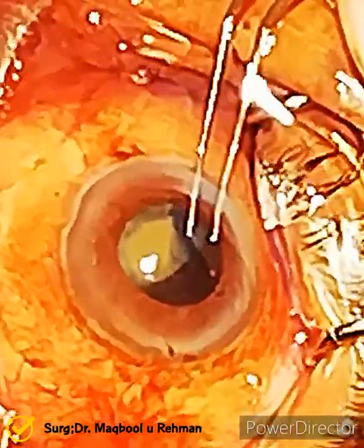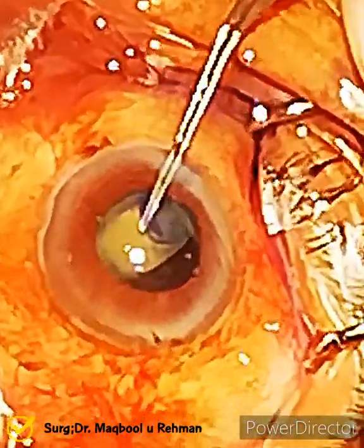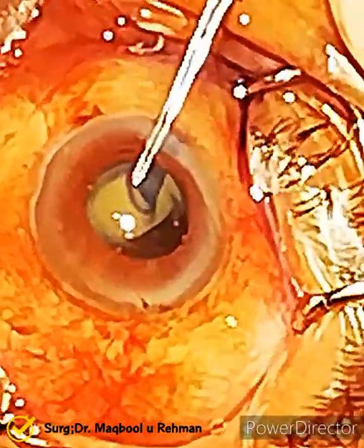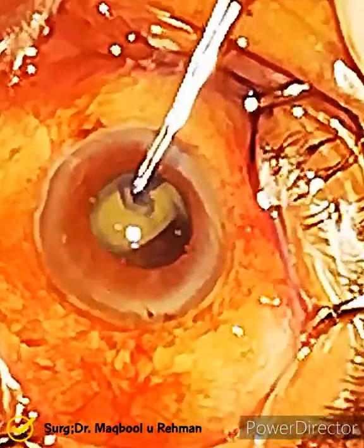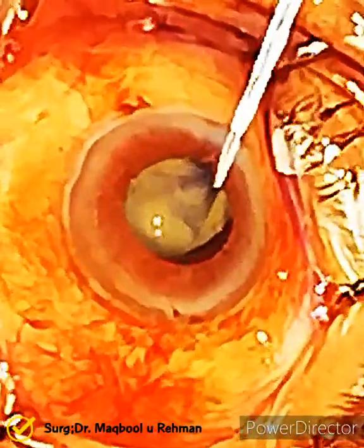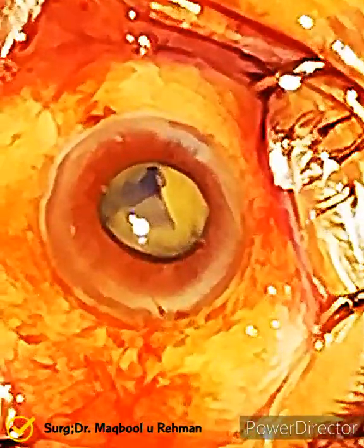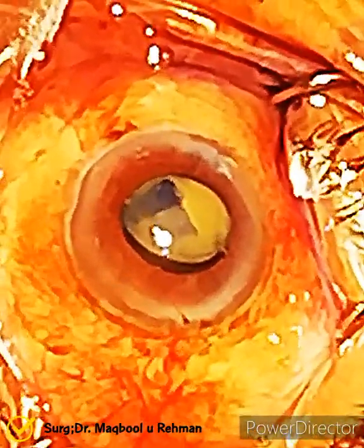Very well — almost 70 percent of the capsulorrhexis has been done. He is struggling a bit with the anterior capsule. Oh, it went too far. I think now he must decide what to do.